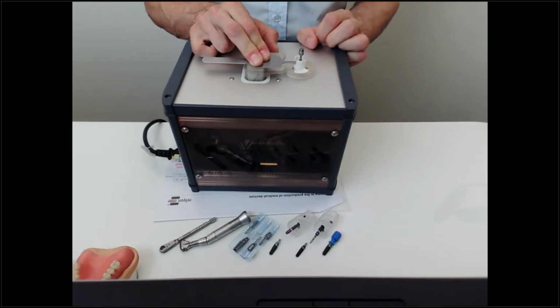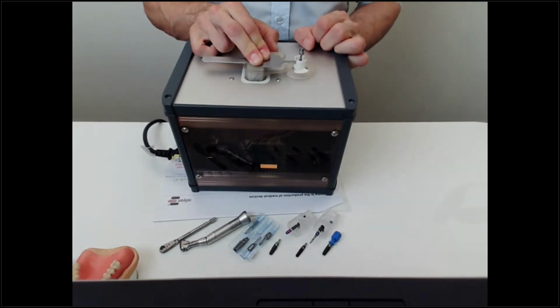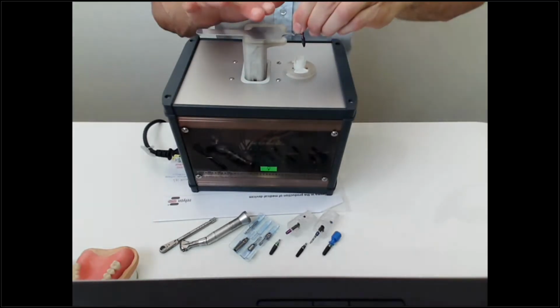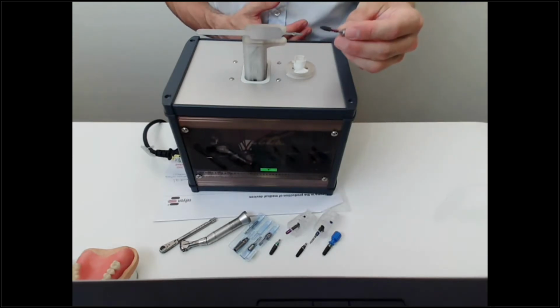The activation takes 20 seconds, and the implant temperature can rise up to, for instance, 50 degrees. This depends a little bit on the implant geometry. Afterwards, there is the cool down phase, where we suck a lot of air through this reactor and cool the implant down to below 39 degrees. Then the implant can easily be ejected, and the implant procedure can follow as usual.